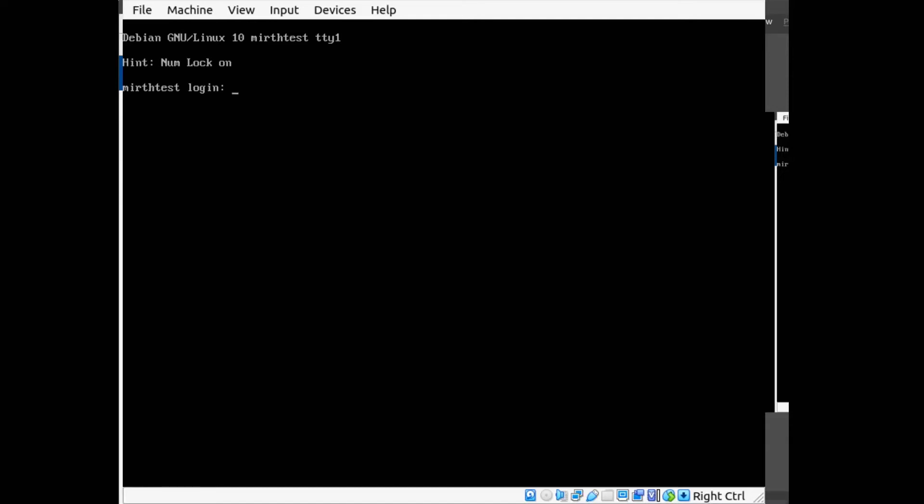You might have noticed that every time you restart our Linux virtual machine it doesn't restart MIRTH Connect. You have to go back in and manually restart MIRTH Connect. So in this video we're going to set it up so that MIRTH Connect will automatically restart whenever our Linux machine restarts.